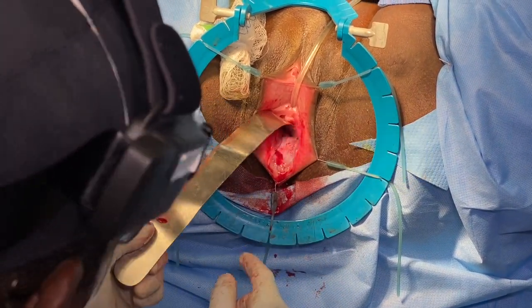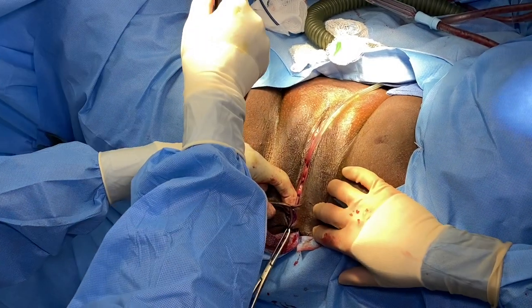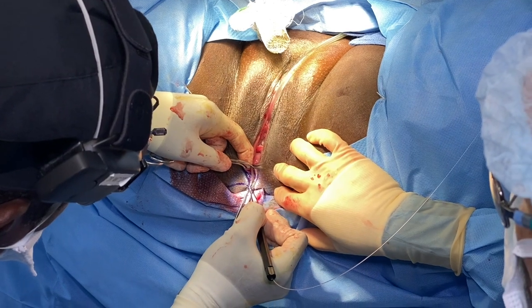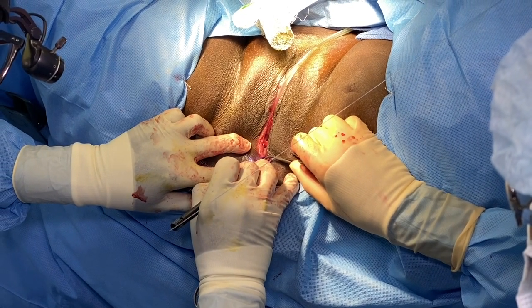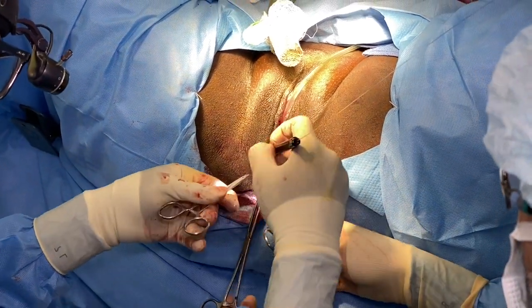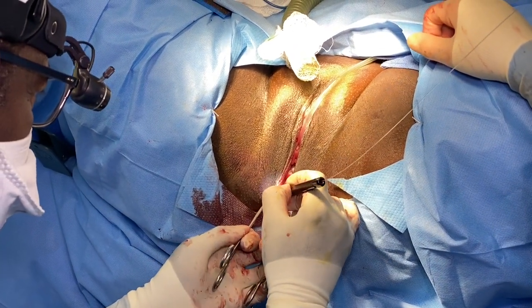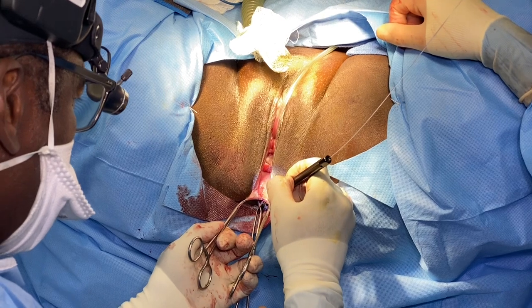Now we're going to work on the posterior wall and deal with this rectocele, this weakness here, and the perineum. We'll bring you back in. I'm going to remove the skin of the perineum now. This is how we're going to actually start entering the posterior wall so we can deal with the most important muscles, the big pelvic floor muscles, the levator ani muscles.